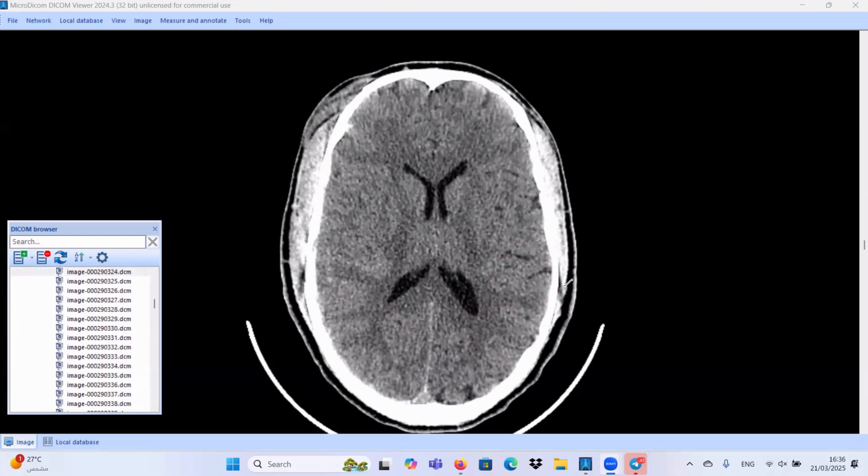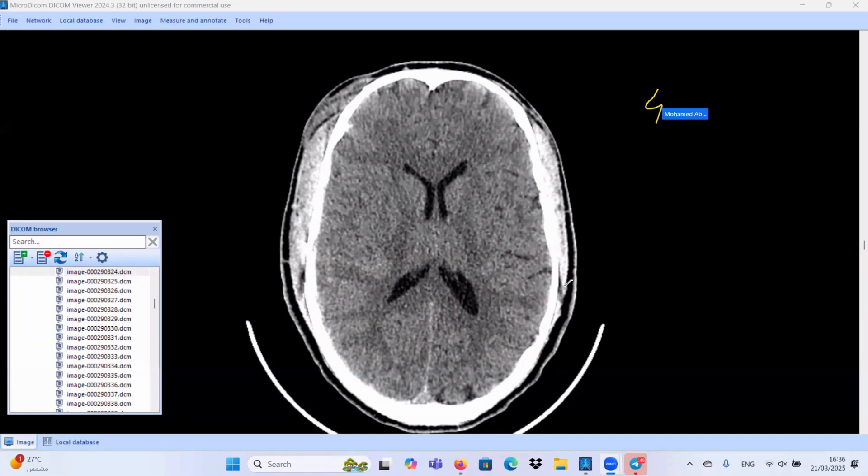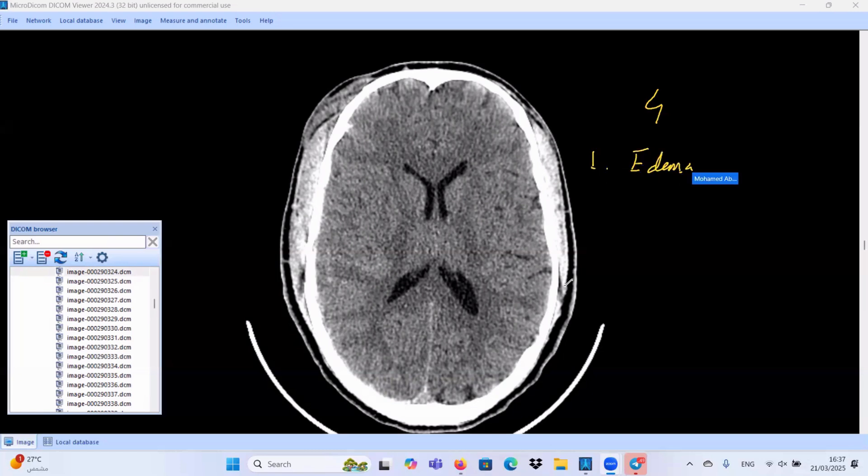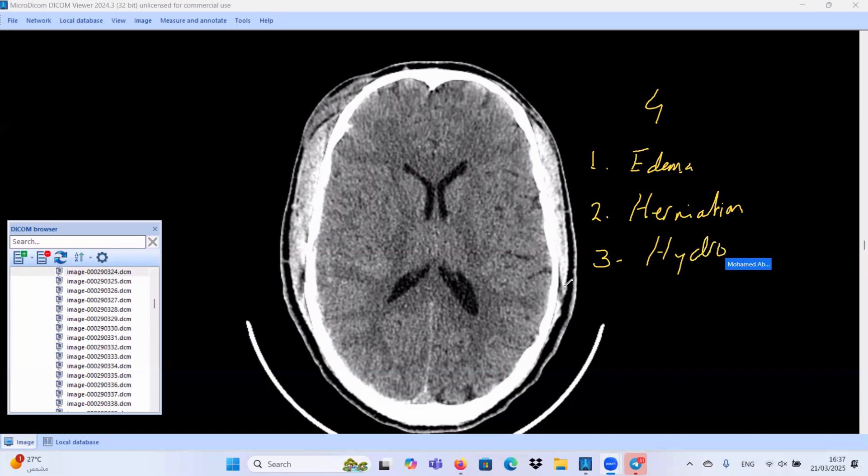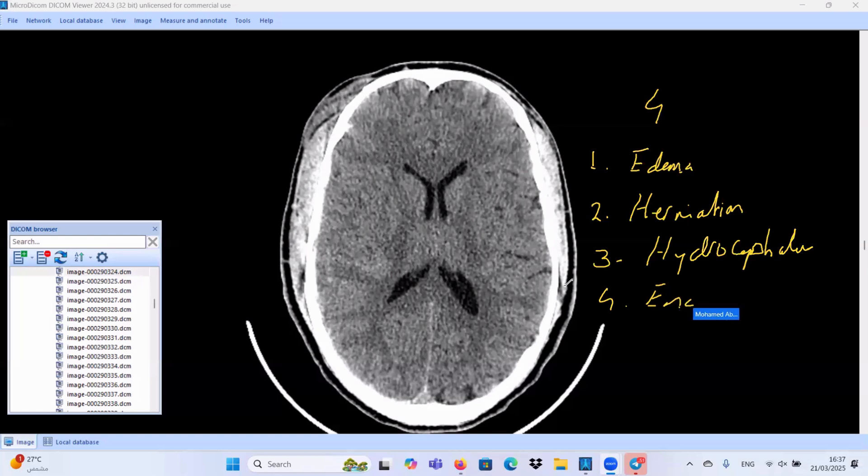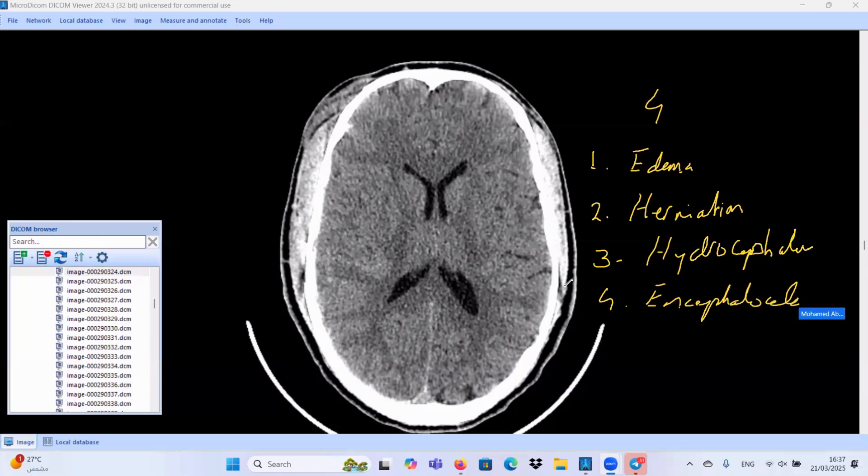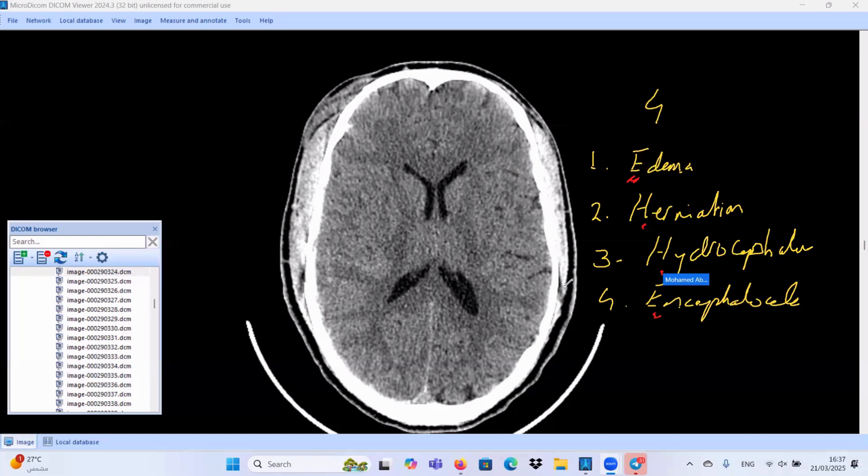So, in any trauma case, as we mentioned before, we should search for four main complications. First, brain edema. Second, brain herniation. Third, hydrocephalus. Fourth, encephalocele. So, we have two E and two H. Encephalocele is considered as a rare late complication and most commonly occurs at the anterior cranial fossa and best demonstrated in the coronal reformatted images. So, let's focus. Is there is any evidence of brain edema?